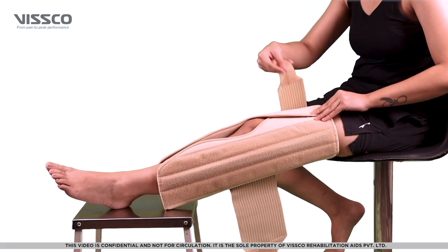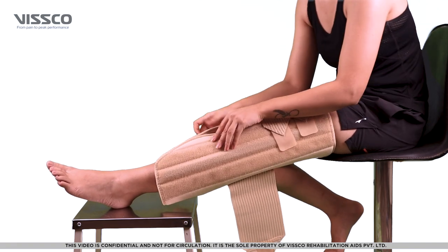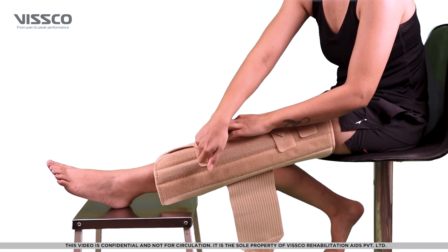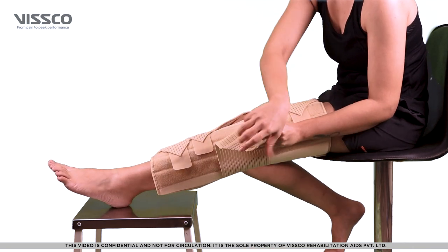Now lock the brace by fixing the velcros one by one. Make sure the brace is fitted snugly and it's not loose. Last, take the center strap and lock it over the patella.